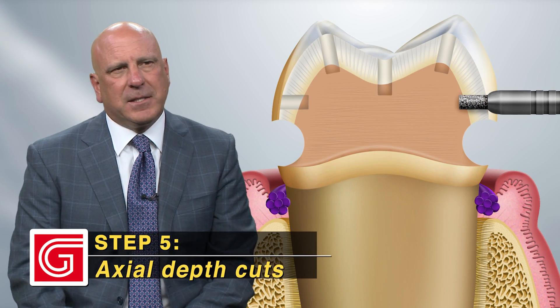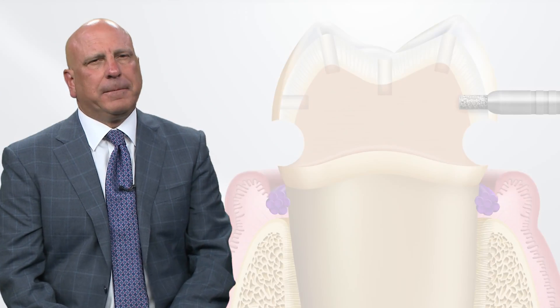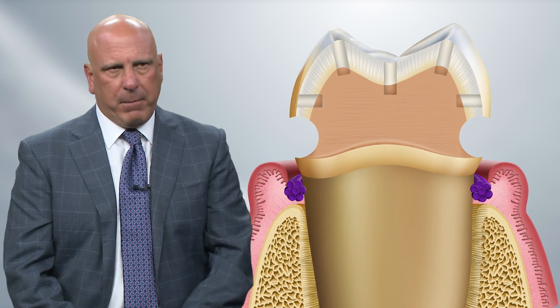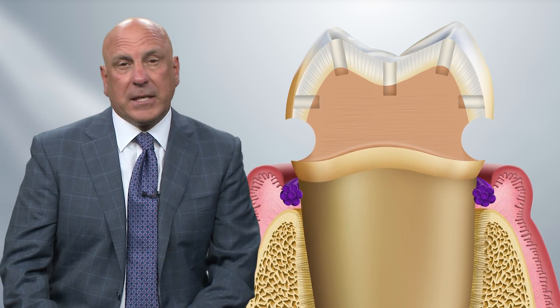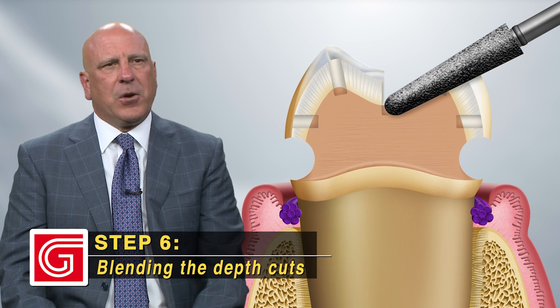Now we need our axial depth cuts at the height of contour on the buccal and the lingual. Once we're done with that, we're ready to fly. We take a little extra time up front, but I refer to this as having GPS or a surgical guide for the preparation — you know when you're done. Then grab the 856025 burr.